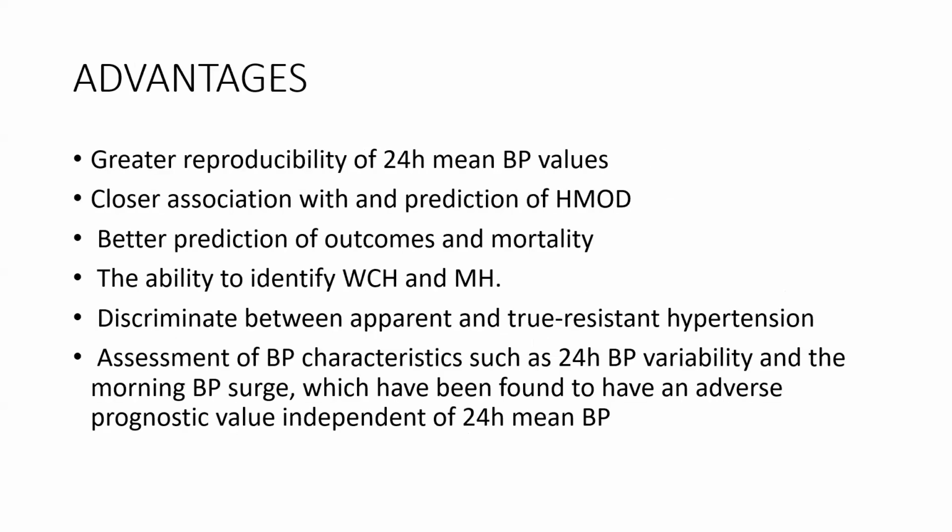It's closely associated with and predicts outcomes better than office blood pressure and mortality.